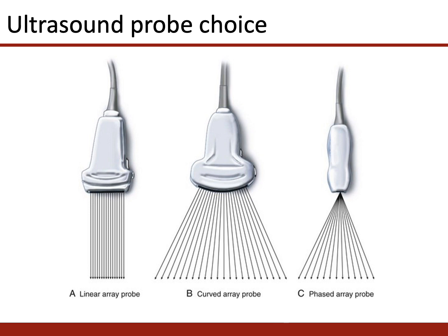The last type of ultrasound probe that we have is the phased array probe, which comes from a singular focal point and is divergent. This is often used for transthoracic echoes. If you can see your target with two of these types of probes, then you would choose the higher frequency probe to get a better quality image.